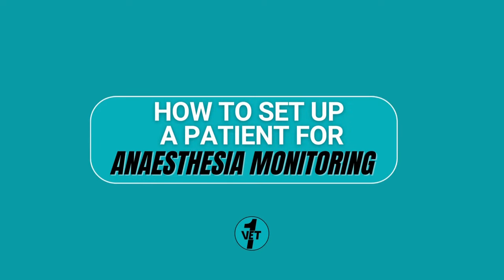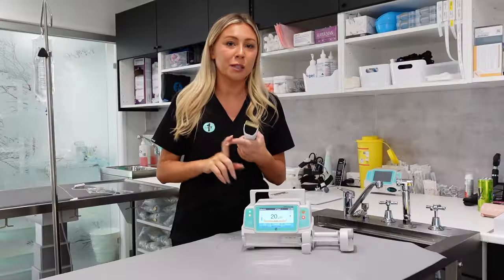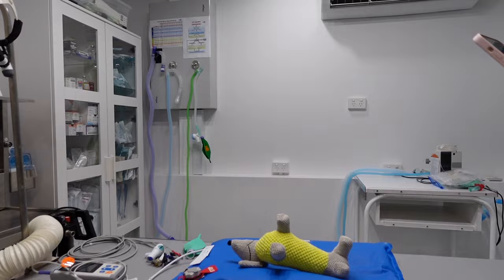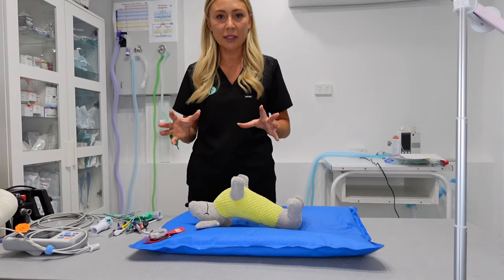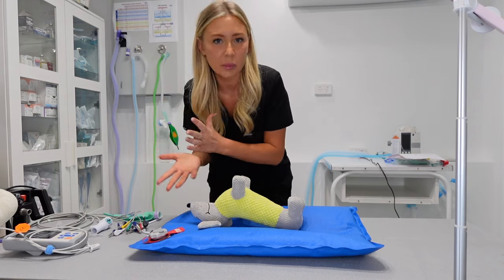Hi guys, I'm in a clinic today so I can do a bit of a bloggy video on getting your patient ready for surgery. I'm just going to go over the basics of attaching a patient to the sensors and the monitors.